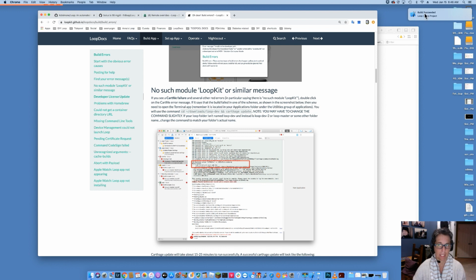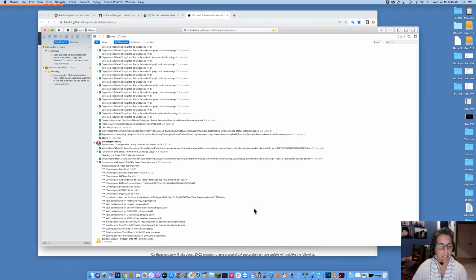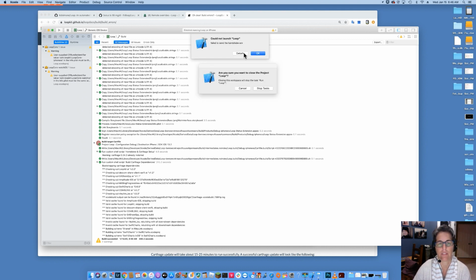Oh, look, build succeeded. Okay, so that's great. Build has succeeded. We can look at it. Want to see? Yes, build succeeded. It's all good. Running Loop on iPhone. Yay. Okay, so I'm going to detach her phone because it's done. Yay. And I can close Xcode now. Well, actually here. Okay. Yes, okay.